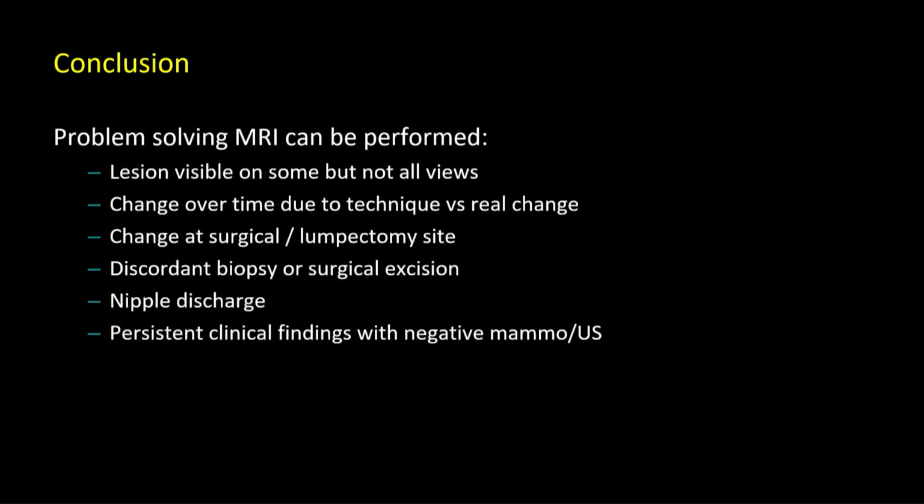So in conclusion, we talked about appropriate problem-solving MRI: lesions visible on some but not all views, is it technique or real change, evaluating the lumpectomy site, discordant biopsy, and clinical situations such as nipple discharge or persistent clinical findings despite a negative mammo or ultrasound.